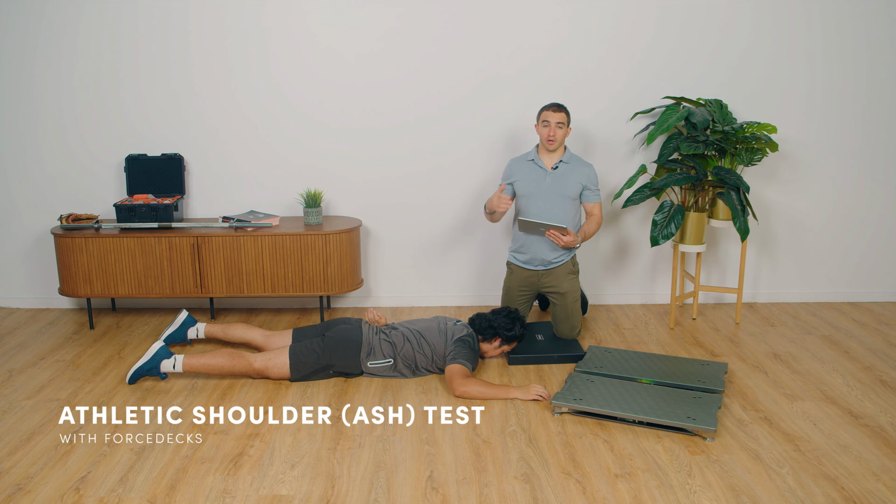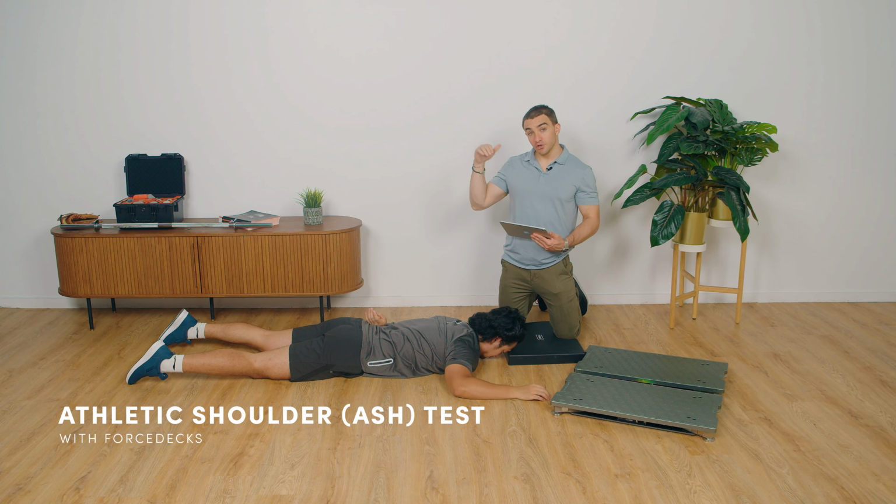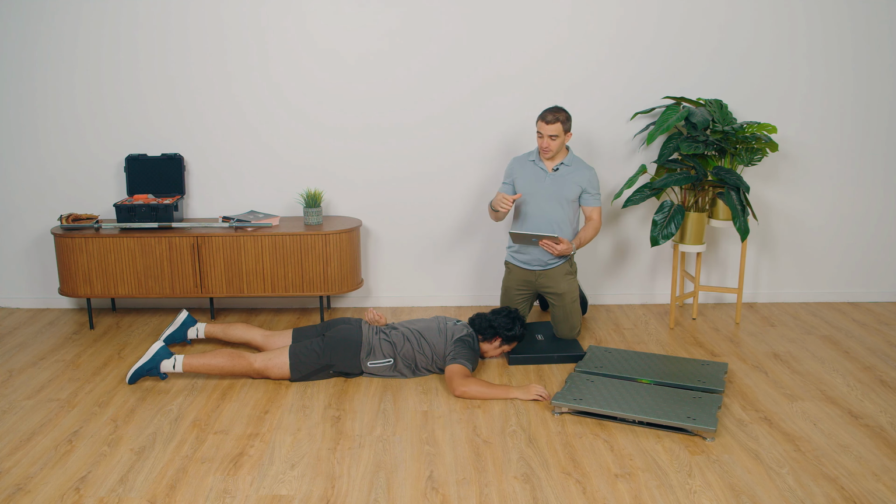So we spoke earlier about implementing the ASH test early on, using a handheld dynamometer like the Dynamo and strapping it to the patient's wrist so we can get through that test quickly and easily. The purpose of doing that is just to look at our peak force values when we're just starting to build strength in our rehab, but not yet looking at rate of force development. But when we start to improve our intent and RFD, we want to then progress our testing to the force plates. And so just for the purposes of this prac, we'll just do an eye test.